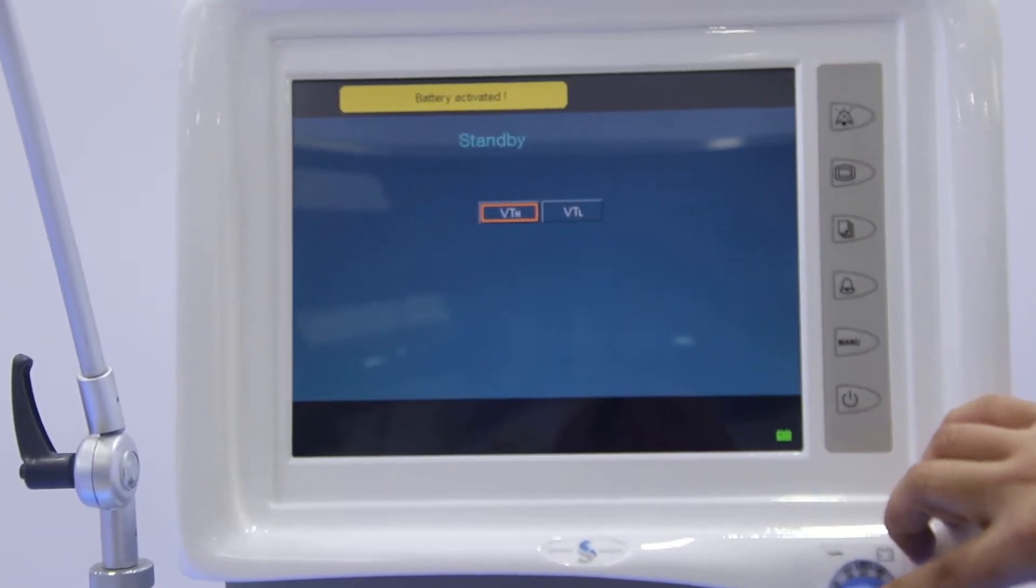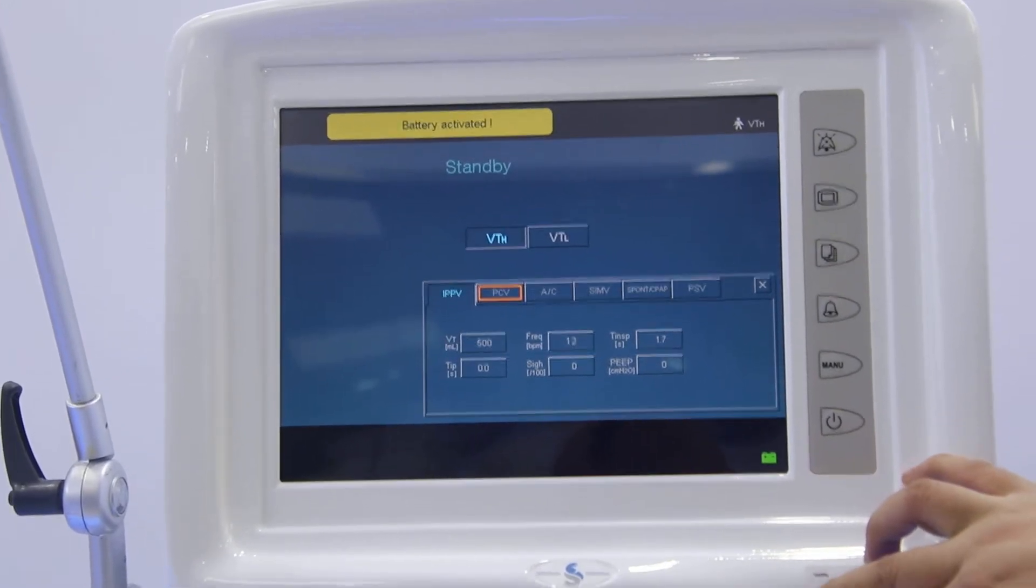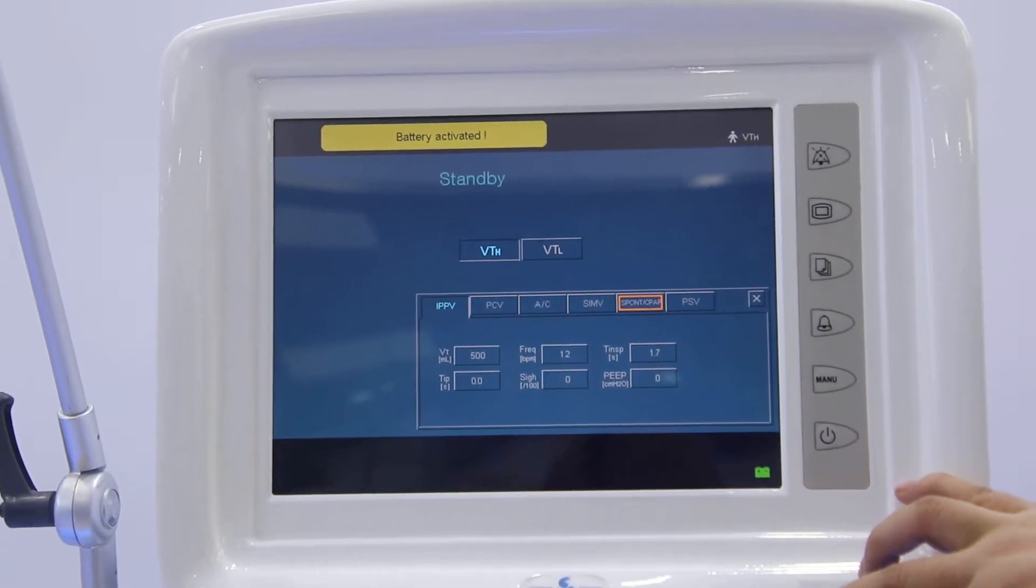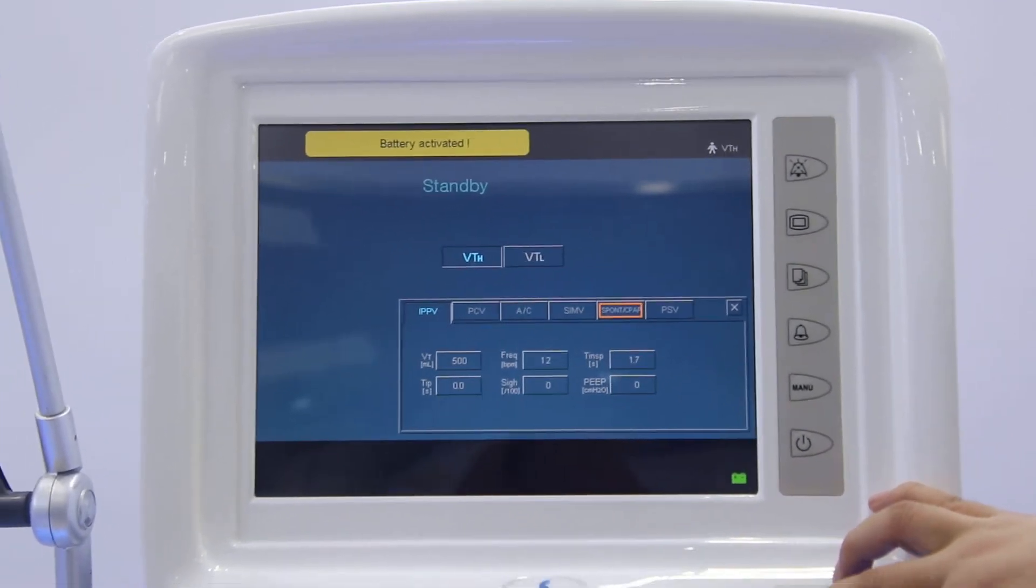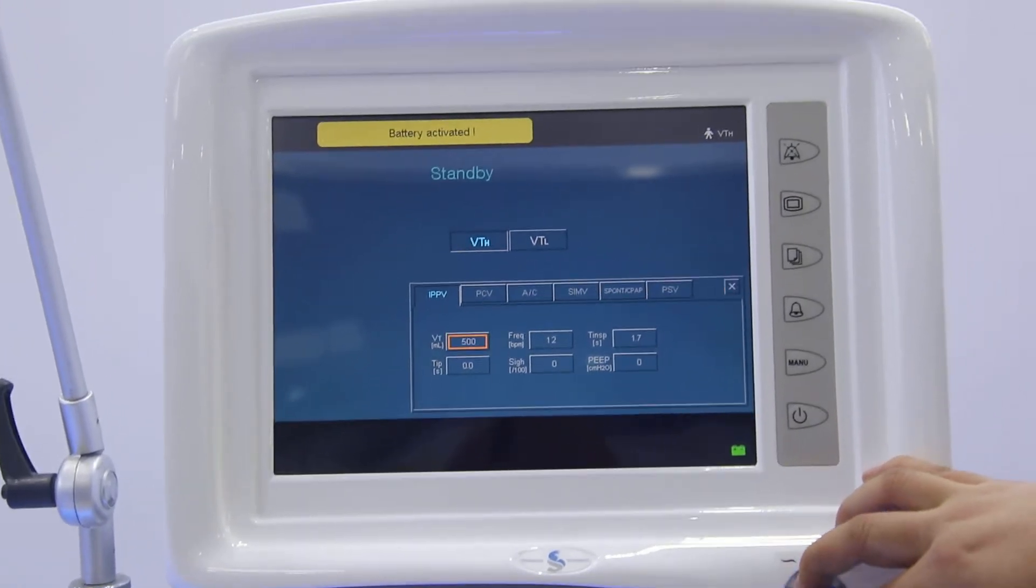Once we press the rotate button, we can do the ventilation mode choosing first. It includes IPPV, PCV, AC, SIMV, spontaneous CPAP, and PSV. So it means our machine has both the volume control and also the pressure control mode. We can use for different patients.